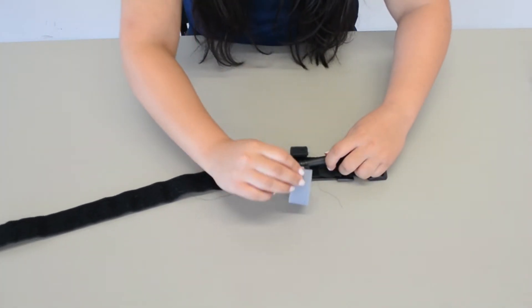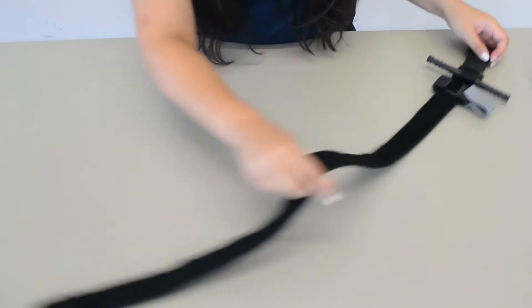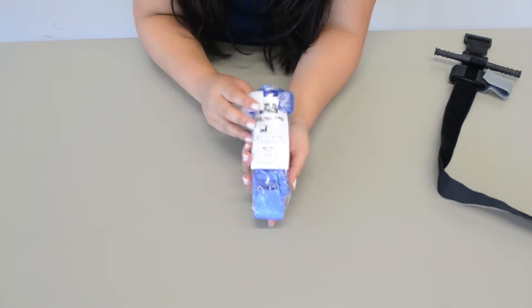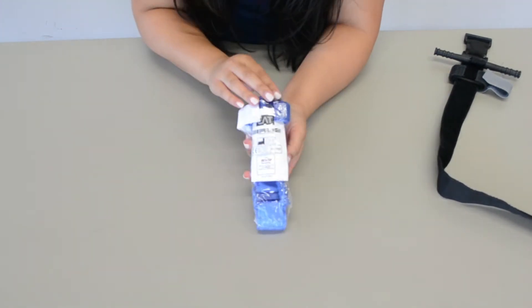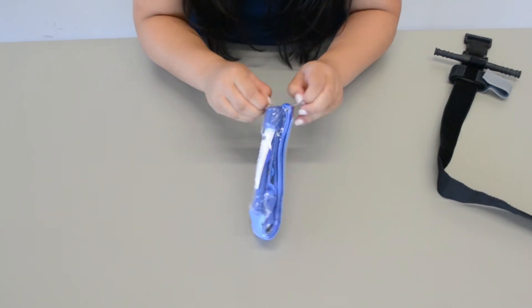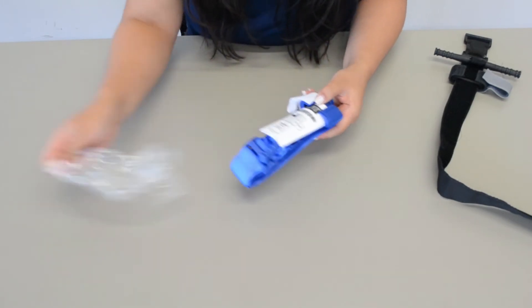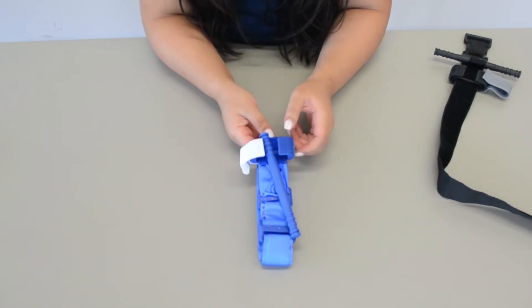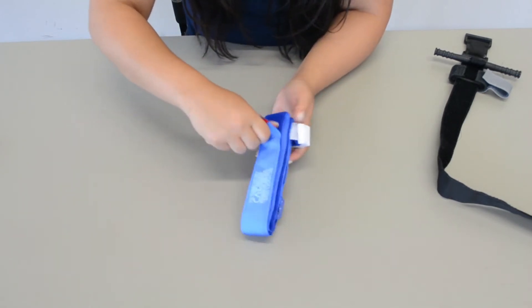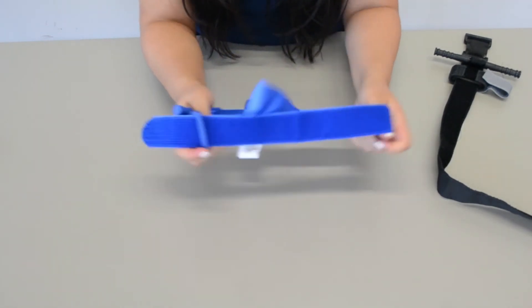So this black tourniquet is what a real tourniquet looks like. Our training tourniquets are blue, and the real ones come in packages like this. You're just going to go ahead and open it — and they come nicely like this. If you flip it over, this is where you're going to hold it, and you're going to snap it open so that it's ready for use.